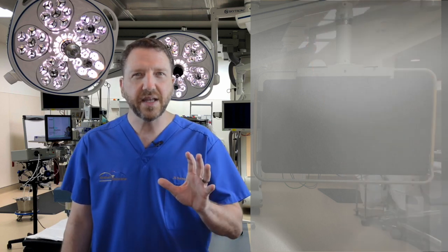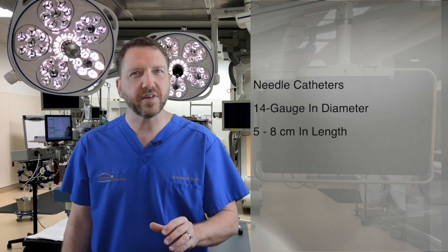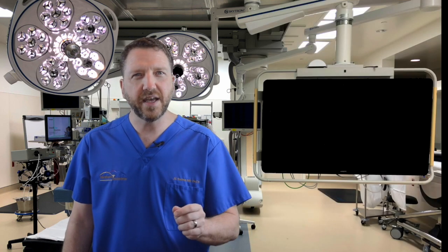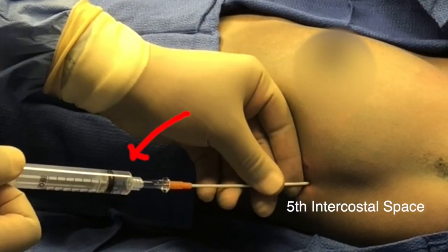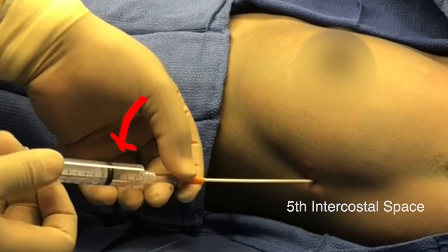Catheters need to be at least 14 gauge in diameter and over 5 to 8 centimeters in length to have a high likelihood of entering the pleural space. Although some recommendations include inserting the needle catheter assembly completely to its hub, I caution against this practice. I recommend attaching the syringe to the needle catheter assembly and pulling back on the plunger as you advance. You will draw back air when you enter the pleural space.